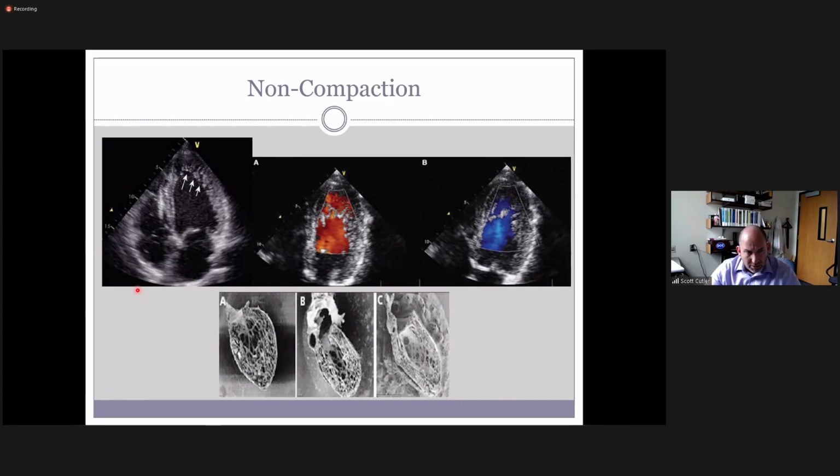So from what we've talked about previously, techs are typically not that good at optimizing your color Doppler to show apical flow. What did I tell you to do if you really want to show good detailed flow at the apex? What should you do on your system?